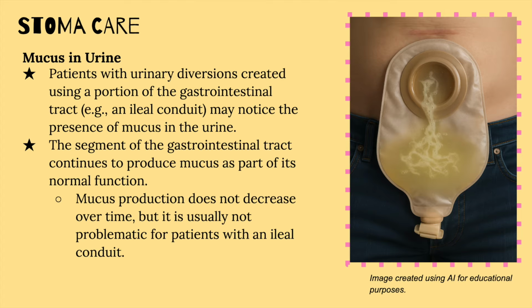Mucus in the urine, however, is usually a problem for those patients who have a continent urinary diversion because mucus buildup can block the catheter used to empty the pouch.